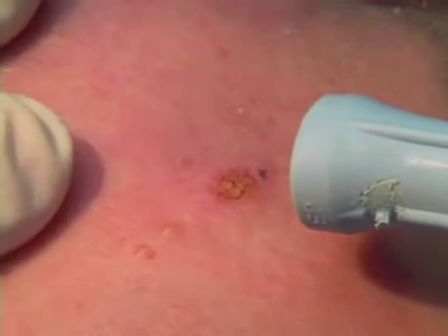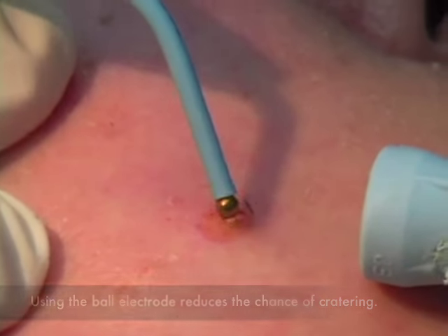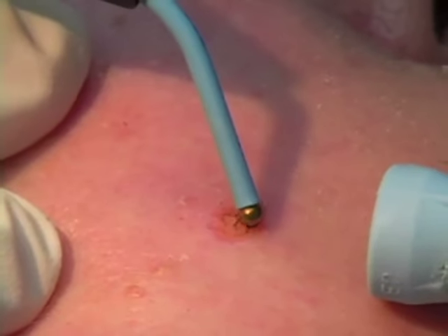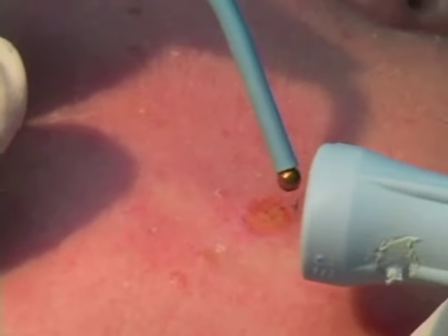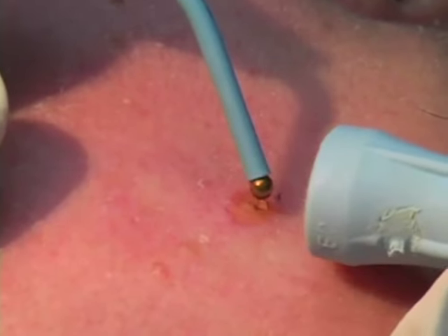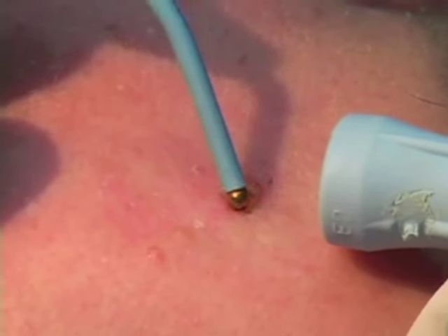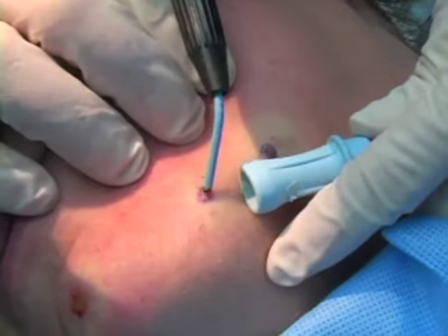One thing with the ball, you tend to get a little less of it. And what I'll do here again is to go back one more time and make these little dimples. And now I've released the skin — it's not on stretch — because you don't want to distort your final result. And we just wipe it down.